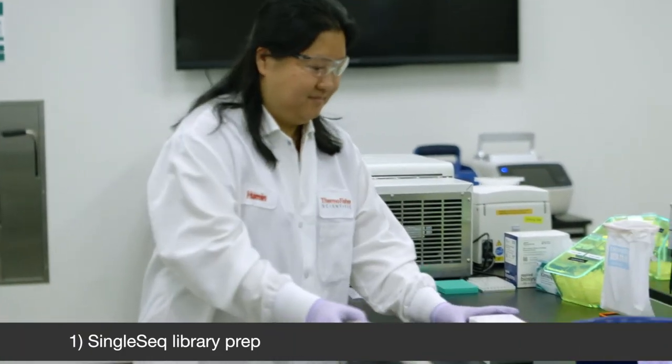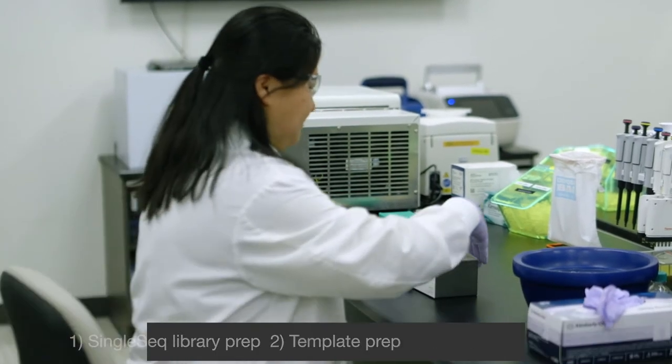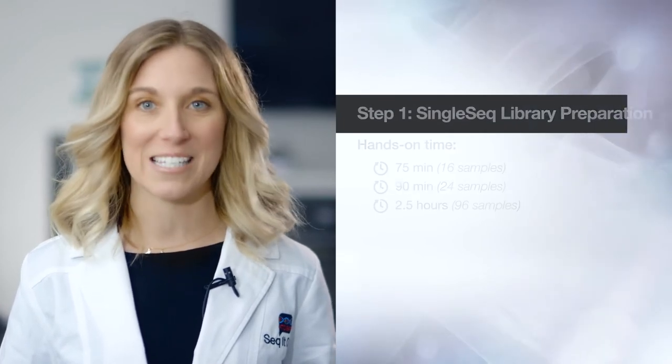The workflow is comprised of three main steps: Single-Seq library prep, template prep, and sequencing and analysis. Single-Seq library prep is super easy with just 90 minutes of hands-on time for 24 samples and two and a half hours for 96 samples.